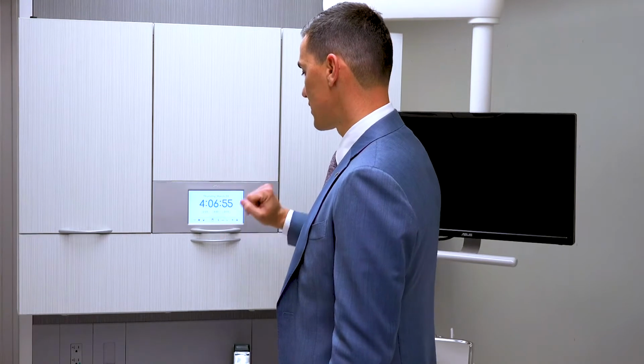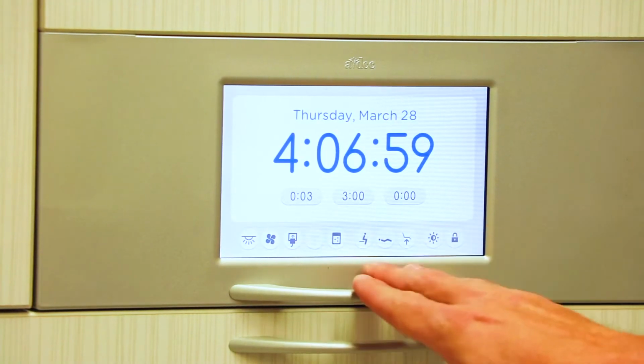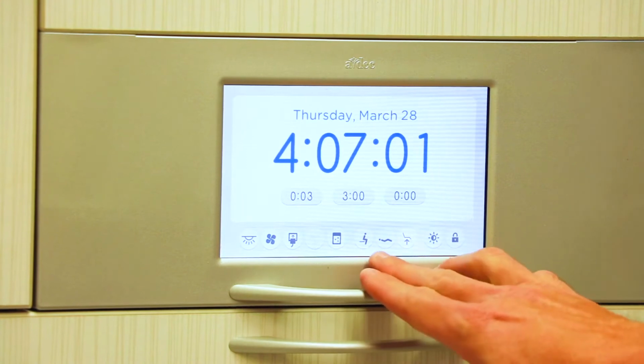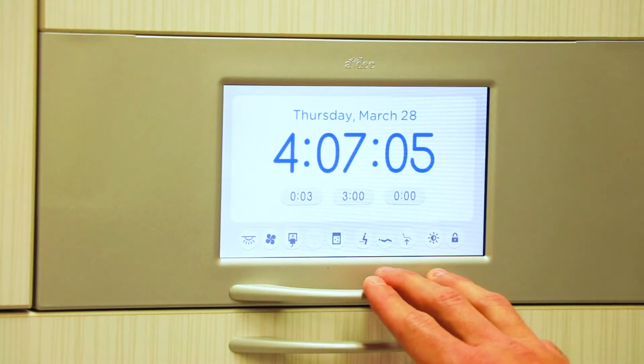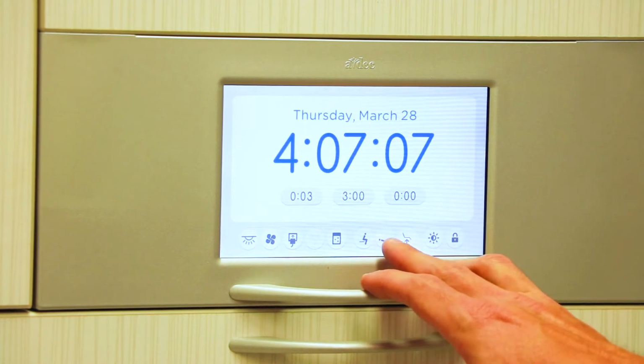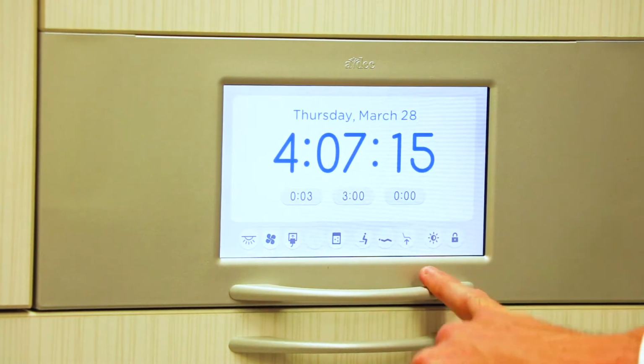Getting out of that, we now have the ability to control the chair as well. So we have 3 chair features on this touchpad in this control center. The first one is our entry and exit. We also have the first treatment position that normally we're utilizing as our maxillary treatment position. And then the button next to that is actually our end of day position.